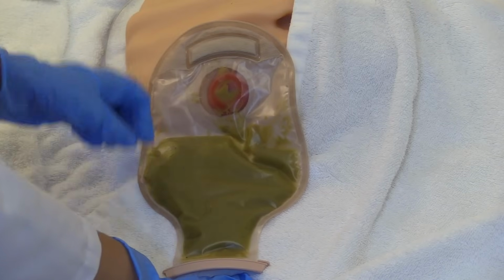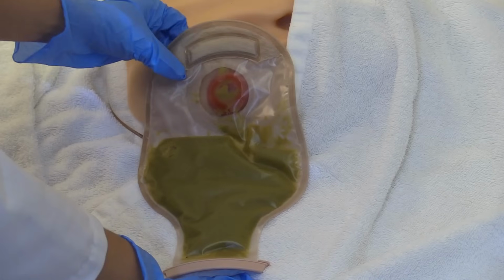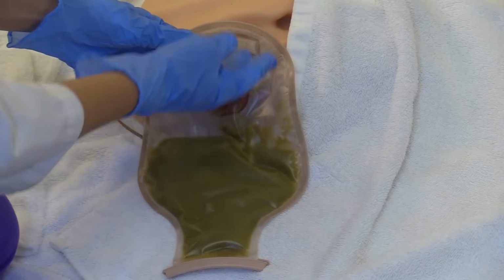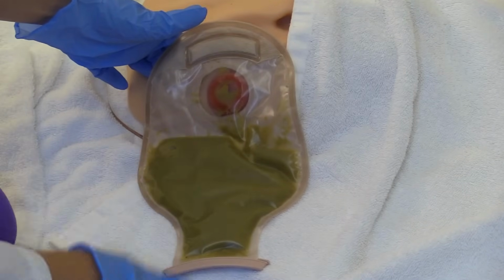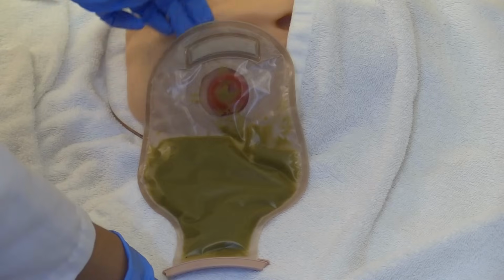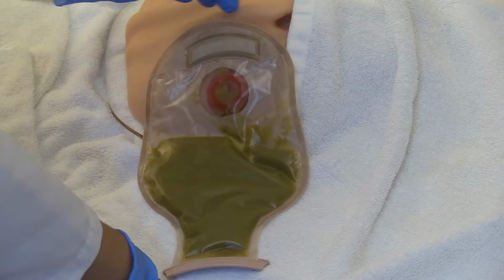So what we're going to do is remove the system, and whenever you do this, you want to do it when the gut is the least active, because you don't want all this stool just coming out on you and making a huge mess. Usually in the morning before breakfast, before the patient eats, is the best time, or ask the patient because they'll know when their stoma puts out the least. But if this is a brand new stoma, they may not know.